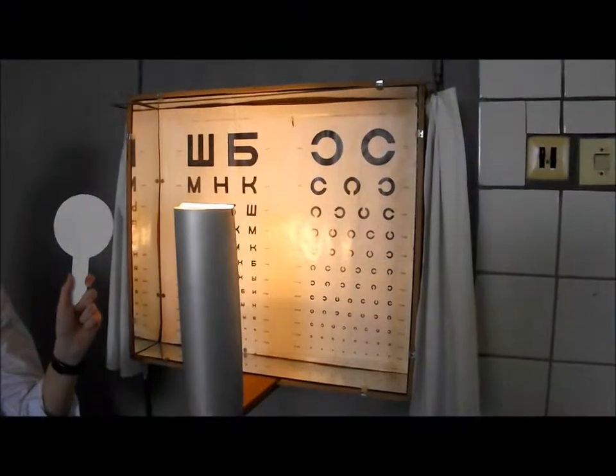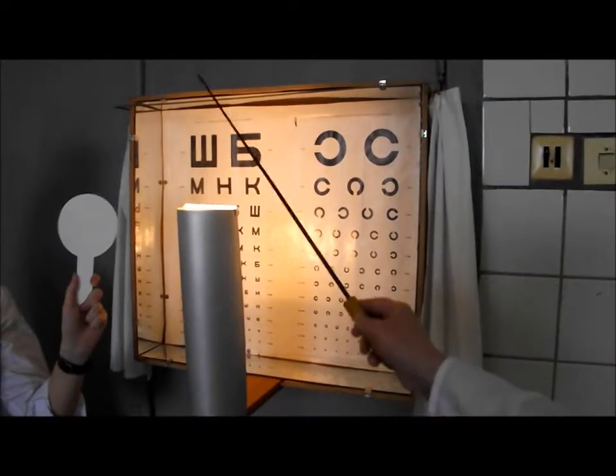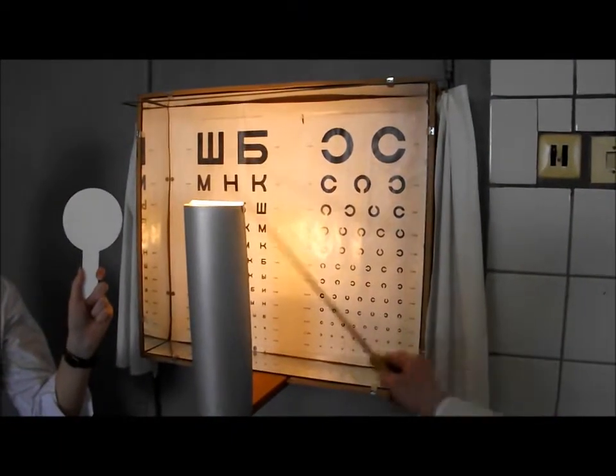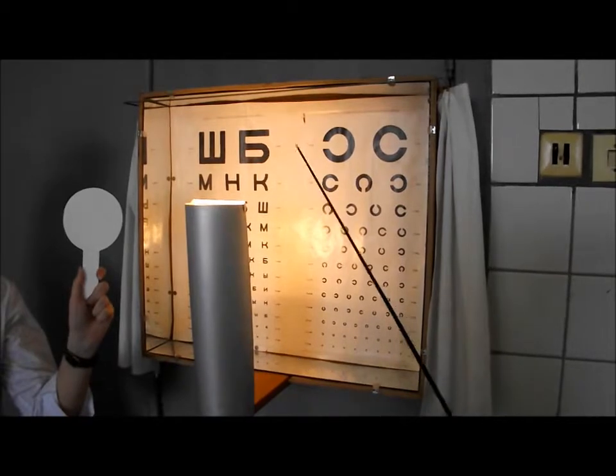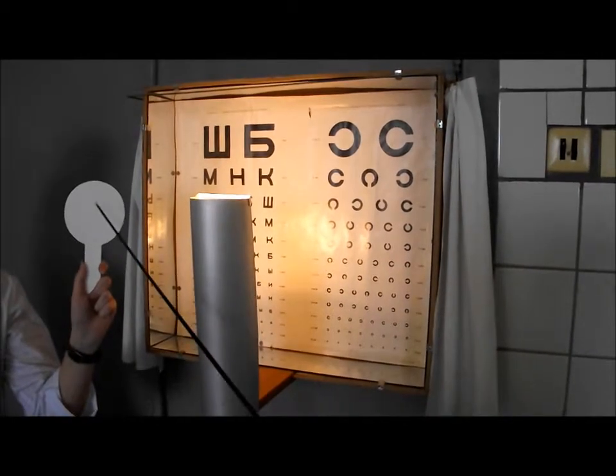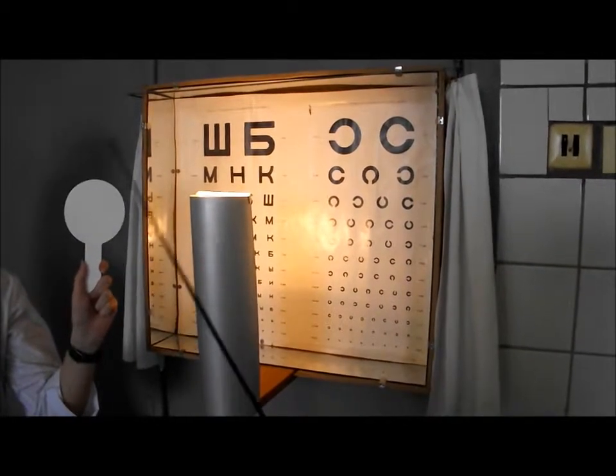For the work we need the apparatus with the special table, 60W lamp, special shield, and pointer.